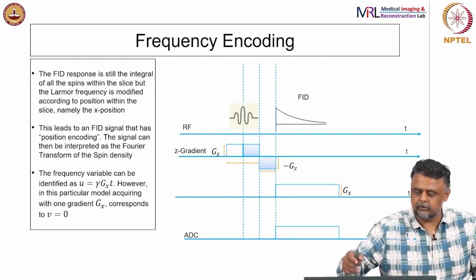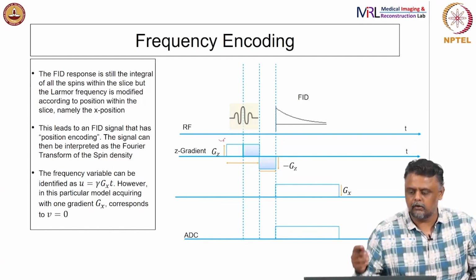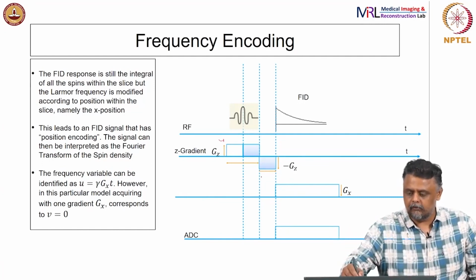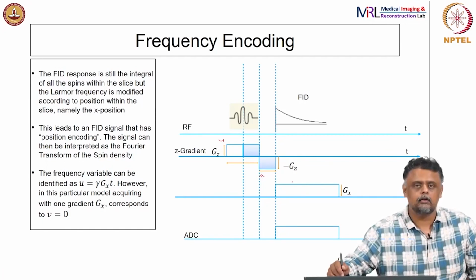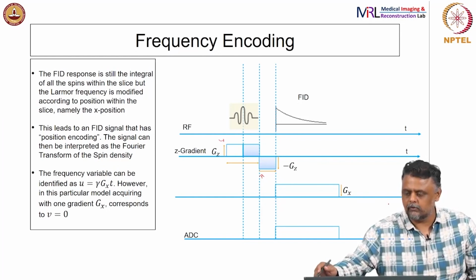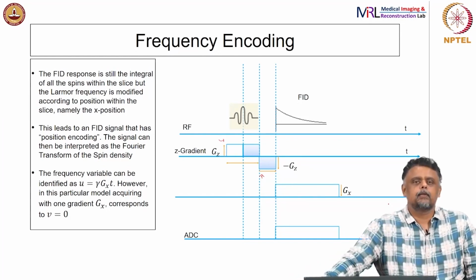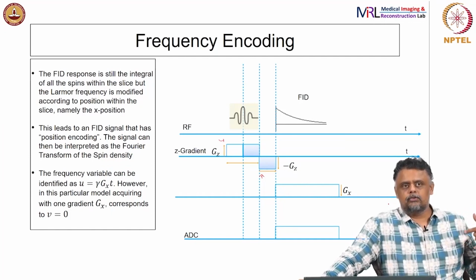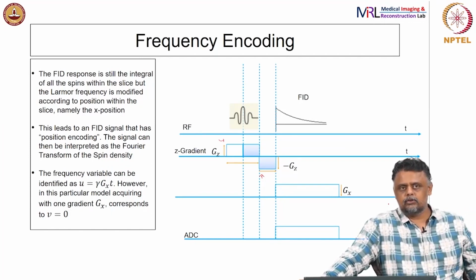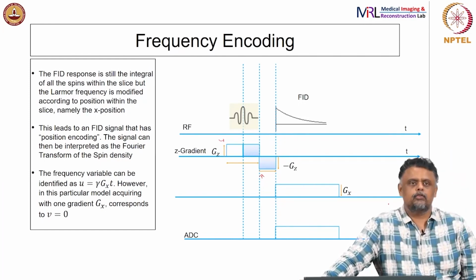So, this is the pulse sequence diagram, RF turned on, the gradient along Z also turned on for slice selection, the refocusing gradient followed by the application of Gx, it is turned on, again along the time axis, it is always on, and during which we actually do the ADC, right. This leads to our image, which is like scanning k space, but you see that this here only corresponds to V equal to 0.